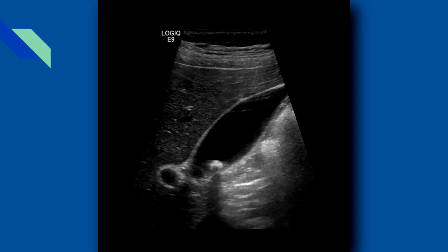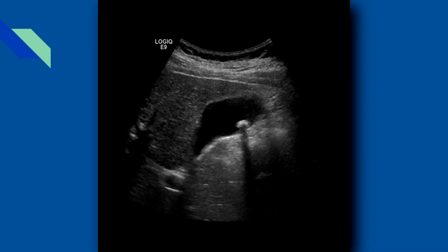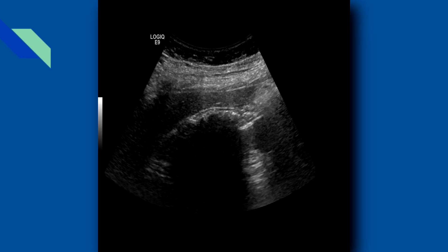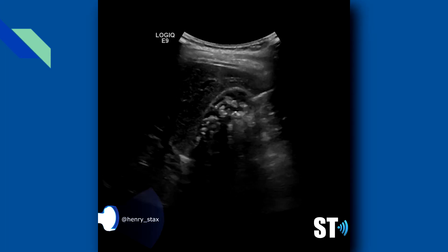Sonographically, you're going to see echogenic mobile structures in the gallbladder, which can be solitary or numerous and vary in size from small to large. Stones will have posterior acoustic shadowing. The gallbladder can be completely filled with stones, obscuring the lumen, leading to the wall echo shadow sign, or WES sign.